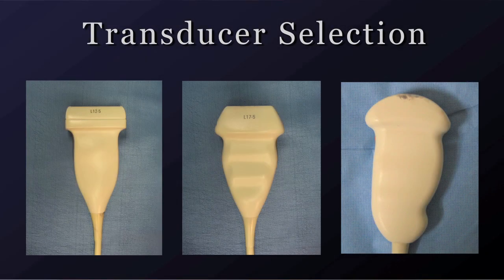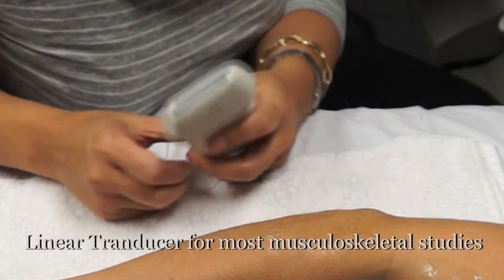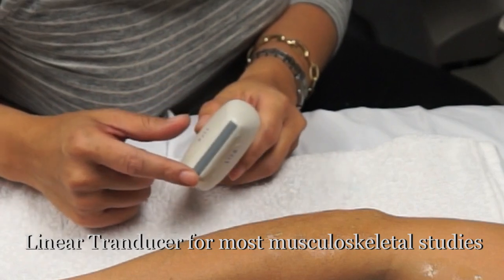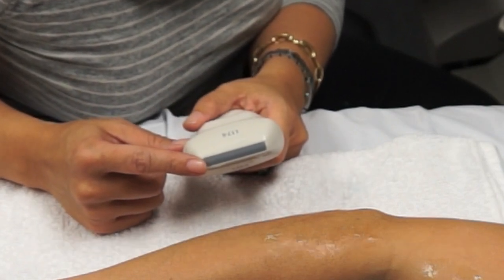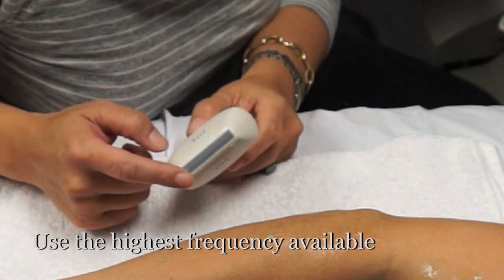Before imaging any structure, it's important to have a basic understanding of transducer selection and image optimization. For most musculoskeletal ultrasound studies, you'll be using a linear transducer such as this one. And as you can see, it has a linear footprint. The second is you would like to use the highest frequency transducer available for that study. So this is a 17 megahertz linear transducer.